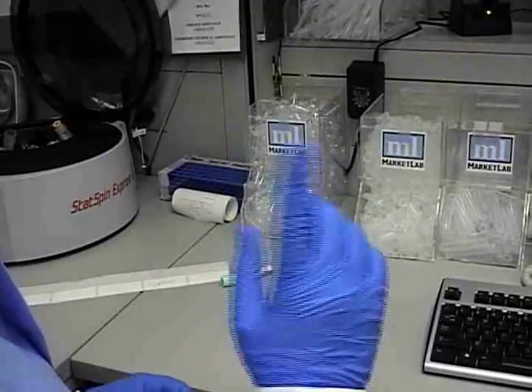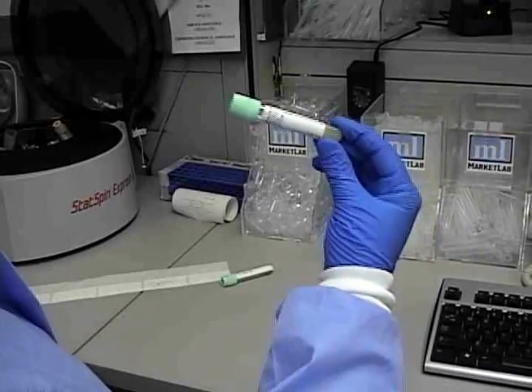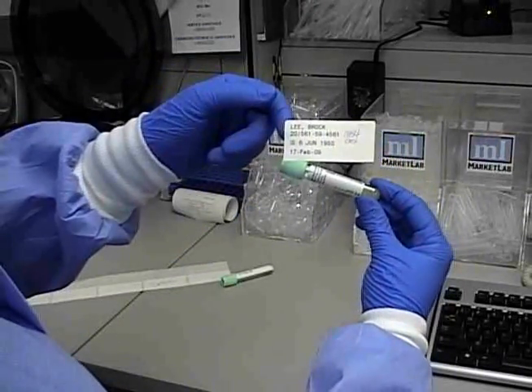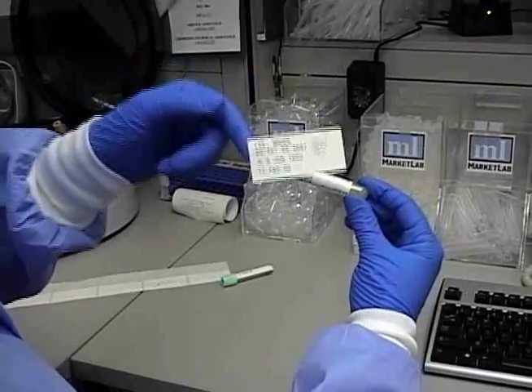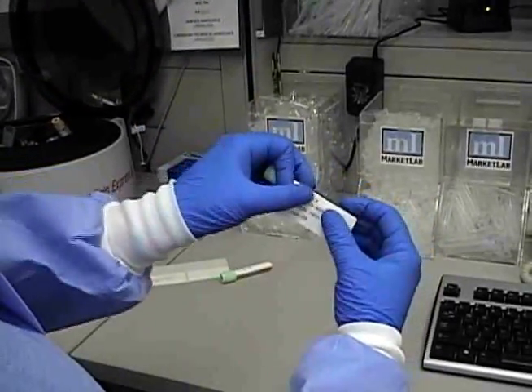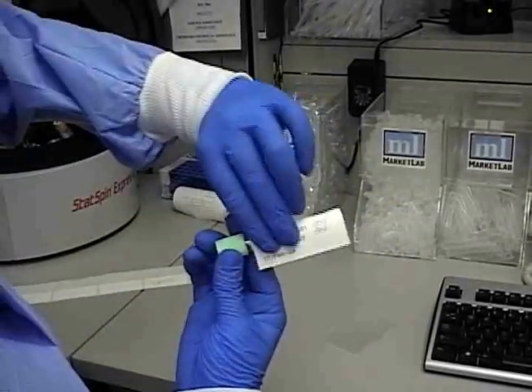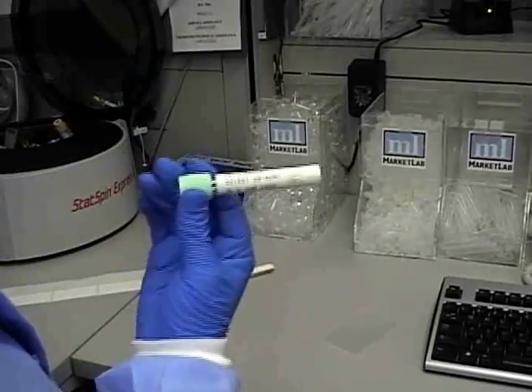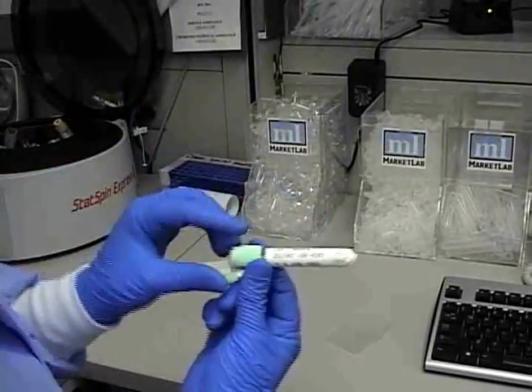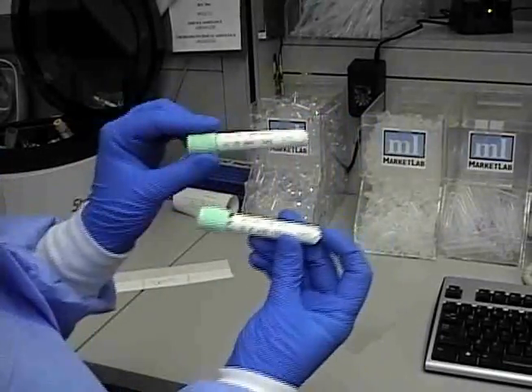If you're left-handed, use this method. Hold the tube in your right hand, opening facing left. Take the properly labeled patient specimen label. Line it up as before. Smooth, and if there's a little overhang, curl it over. Voila, my 3-step method to properly labeled tubes.